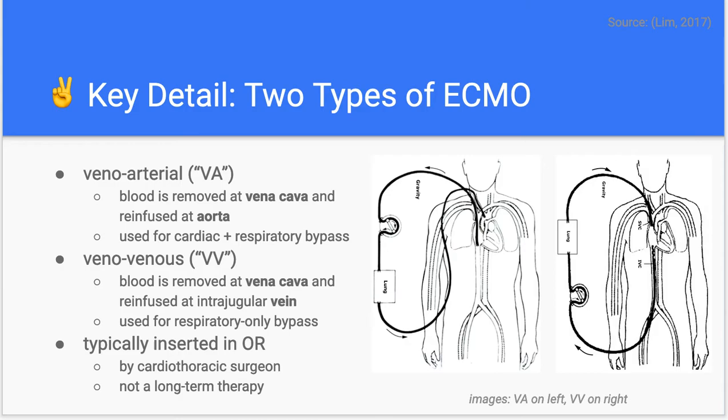You can think about it, I know we talked about different ventilator modes as some being heavier and some being a little lighter. I think patients that end up on VA, veno-arterial ECMO, tend to need the most support, and then oftentimes as they're being weaned down to a little bit less support, they'll be switched over to VV. So essentially starting to get the heart back involved, making sure it's beating well and has good contractility and everything like that. So obviously these are invasive.